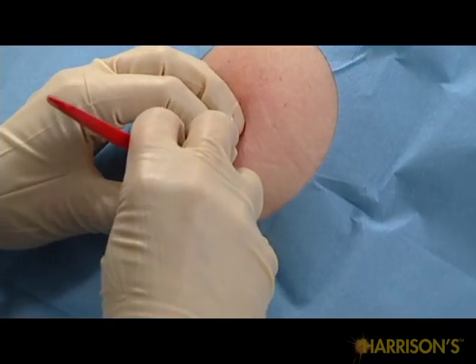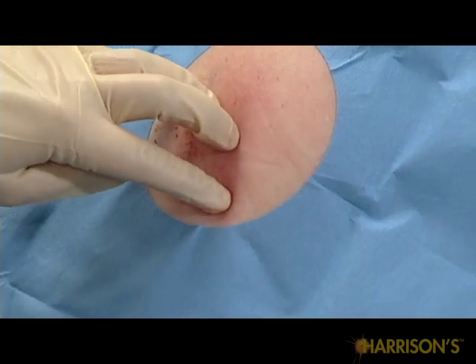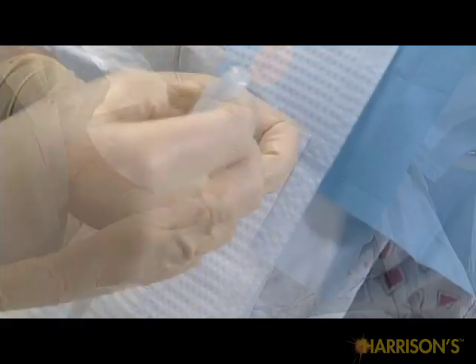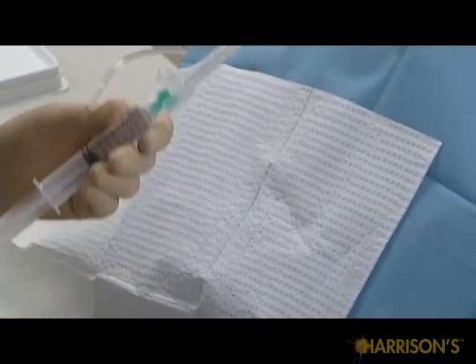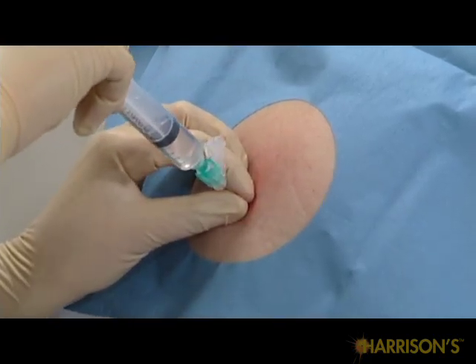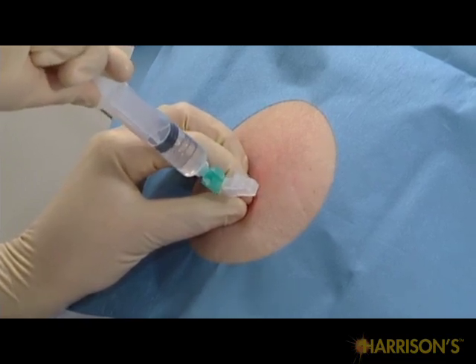Make a 1 millimeter small skin incision with an 11-blade scalpel in the anesthetized area. Now again take the 2-inch 22 gauge needle connected to the syringe with the remaining lidocaine. Numb the pleura for the patient's comfort. This can also help guide catheter placement.